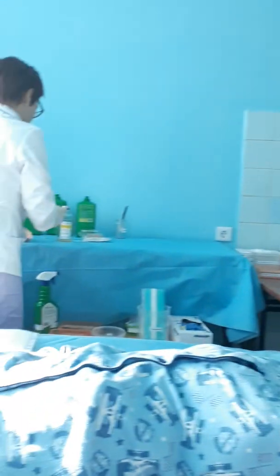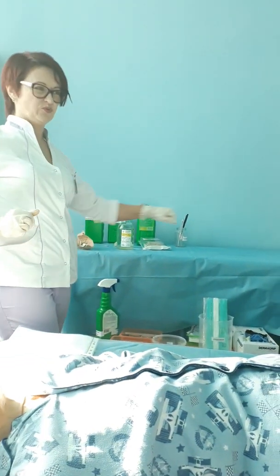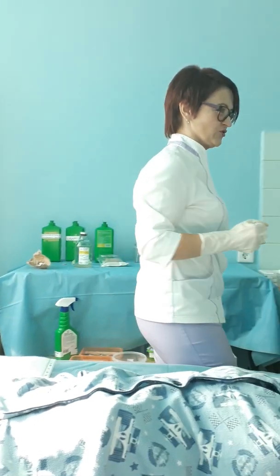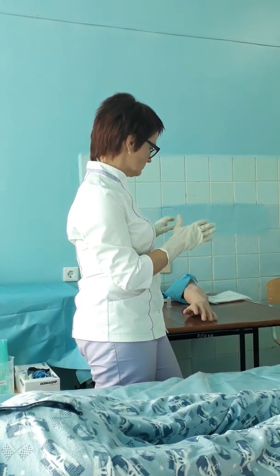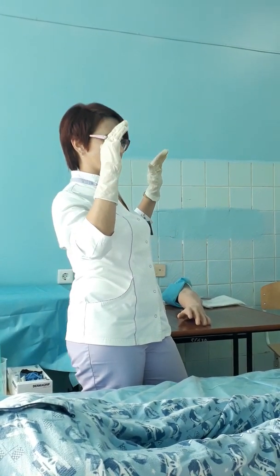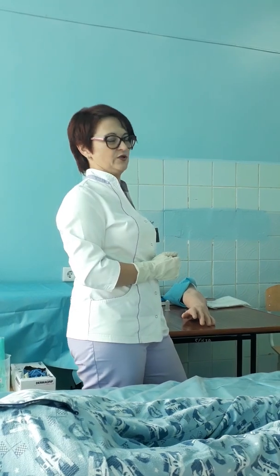And afterwards, with your manipulative table and your stand, you go into the patient room. More often, intravenous infusion will take a long time, and more often you will do it in the patient room. You come to the patient room and start to communicate. How will you do it?